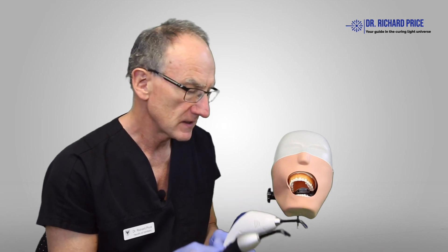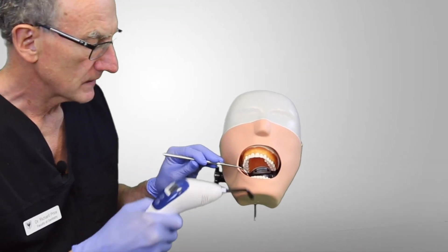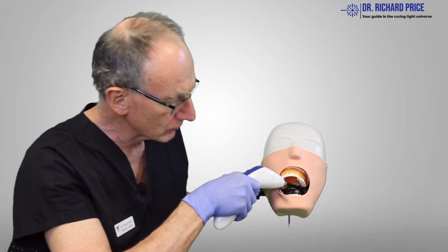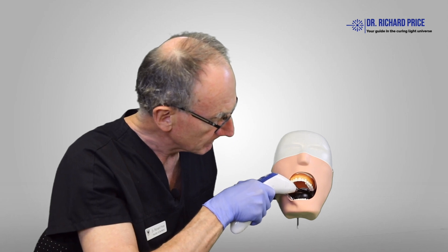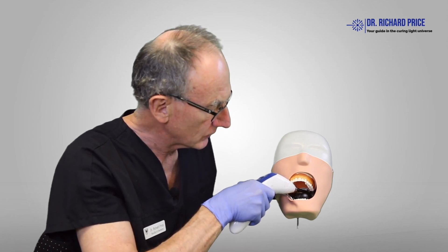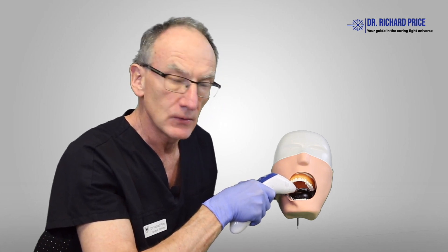So let's have a look using this mannequin here. Taking this curing light, we're going to see if we can access the last molar in the mouth. Look how wide the patient has to open for us to be able to get in so that we can light cure that last restoration back there if you had to place one in the molar tooth.